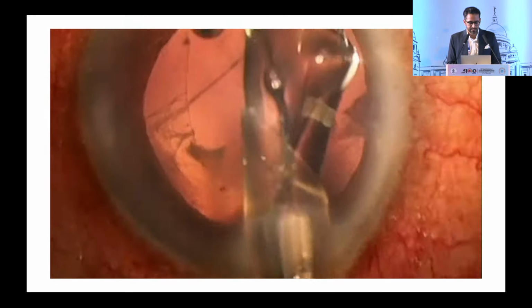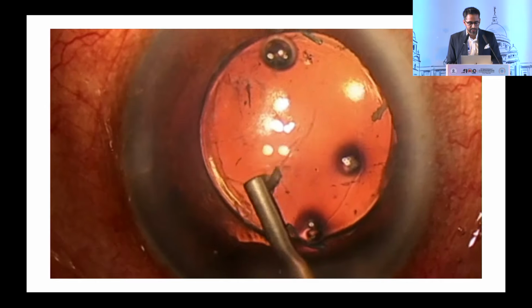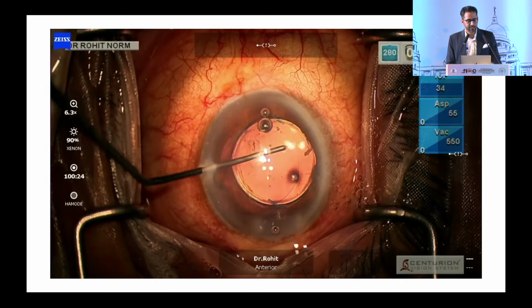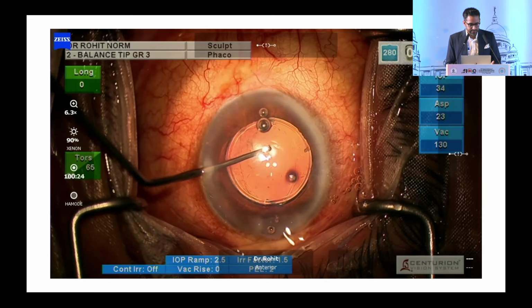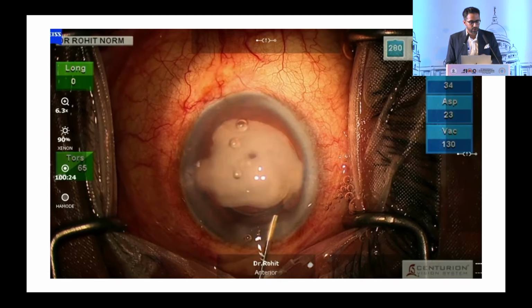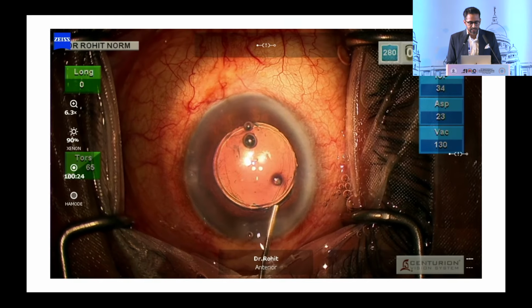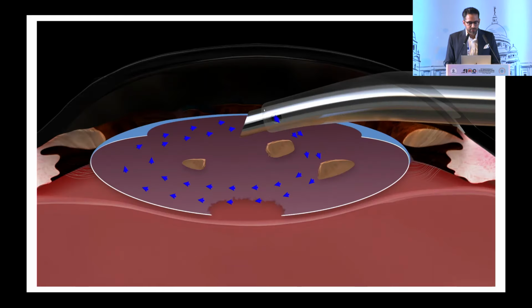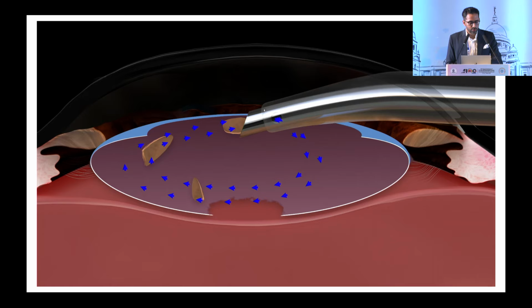As you can see, the pre-existing defect is visible now, and I am injecting the 3-piece IOL in the sulcus. The remaining nuclear piece which was lying there also came out. Had the hyaloid face been broken, I think it would not have. Always remember to use triamcinolone, which confirmed absence of vitreous, and the case was completed. Just in a graphical animation, with low fluidics and following all the prerequisites, these nuclear pieces just don't go back, and we use the hyaloid face to our advantage.